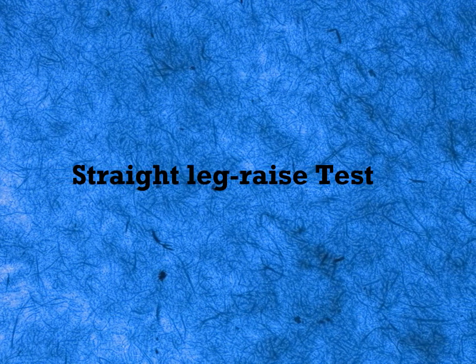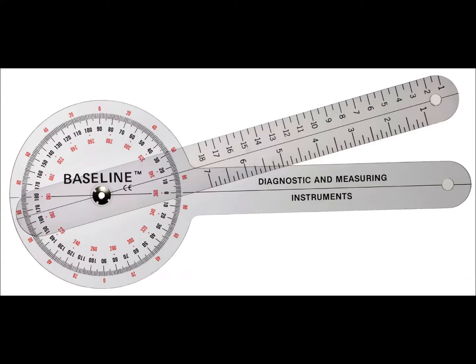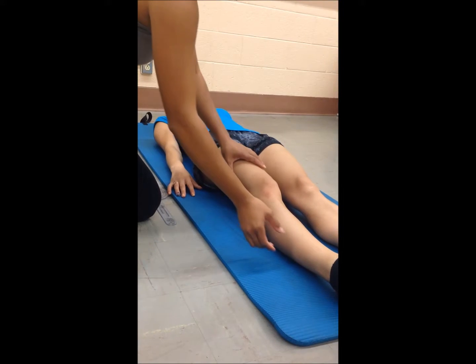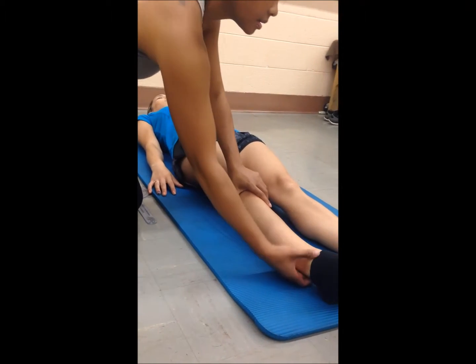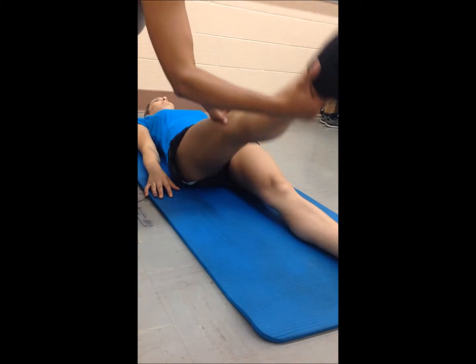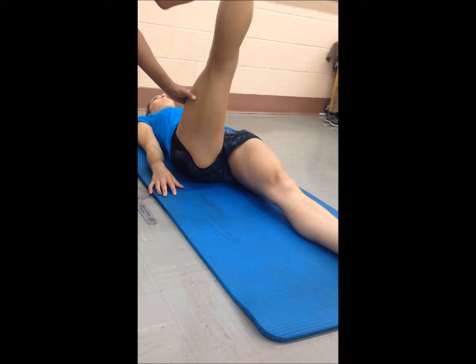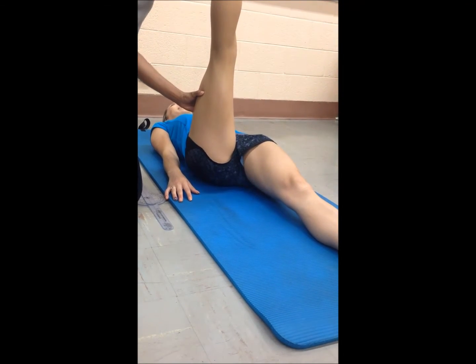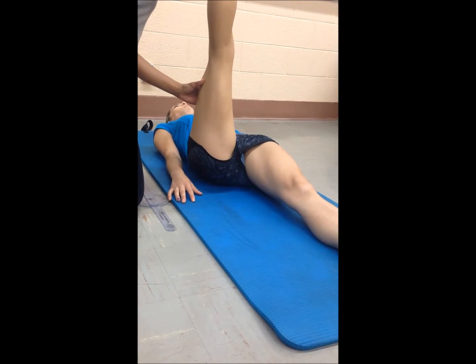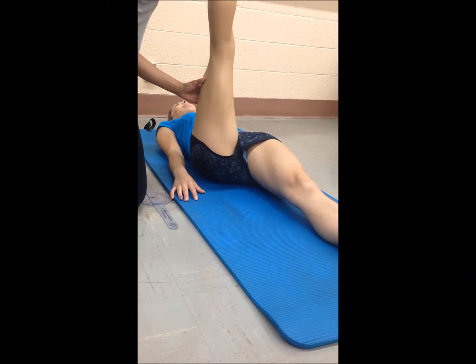The straight leg raise test. This test assesses flexibility of the hip extensors. You will need a mat and a goniometer. Have your subject lie on the floor on their back. Raise one of the subject's legs and push forward to get a good stretch, while ensuring the other leg remains extended and flat on the mat. You will then measure the angle of the flexion.